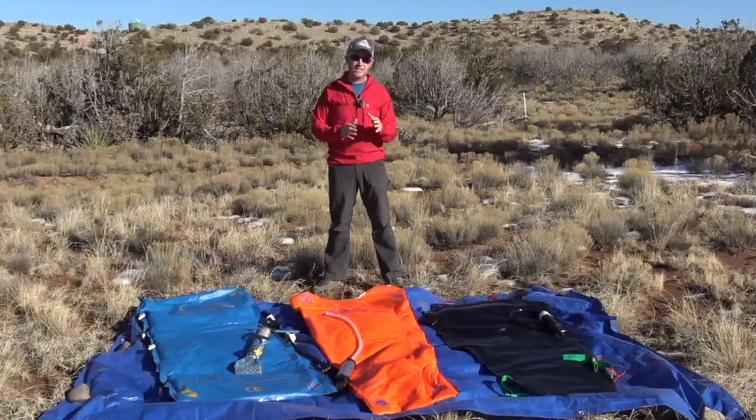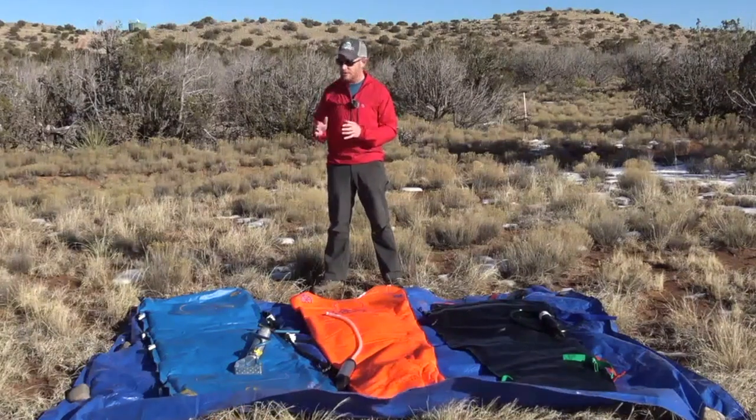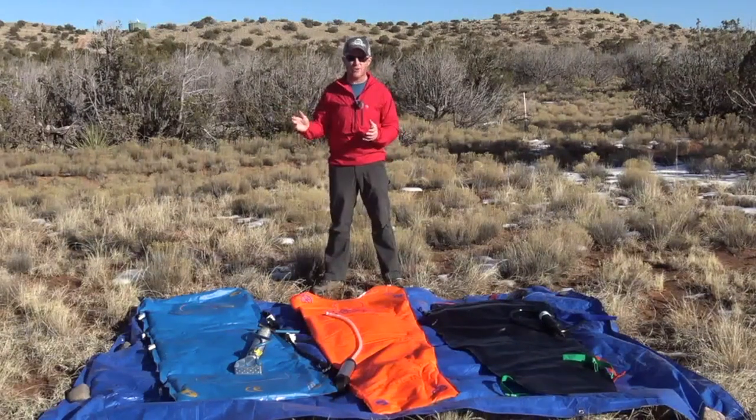In the past, there has been some reluctance among some rescue teams to fully adopt routine use of a vacuum mattress, and a lot of that has been due to some of the limitations of the technology we've had in the past. Particularly, some of these older models were not quite as durable, especially out here in a desert environment where you're exposed to cactuses and sharp rocks.